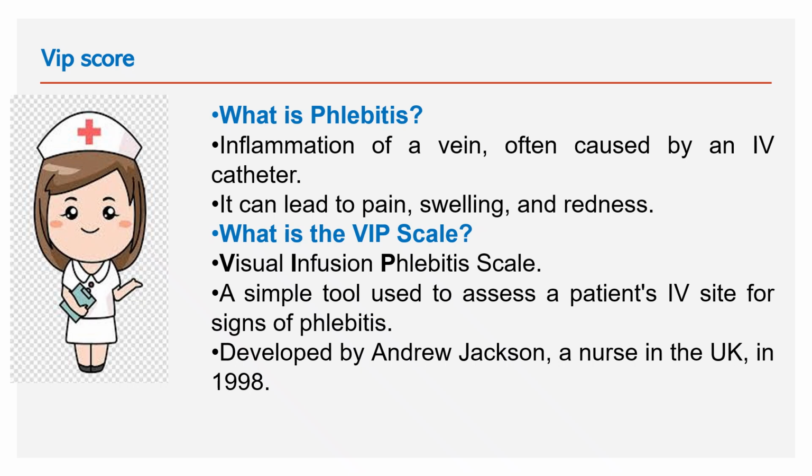What is the VIP scale? Visual Infusion Phlebitis Scale. It is a simple tool to assess the patient's IV site for signs of phlebitis. It was developed by a nurse, Andrew Jackson, in 1998. He was a nurse in the UK.